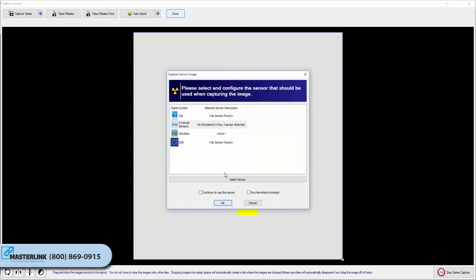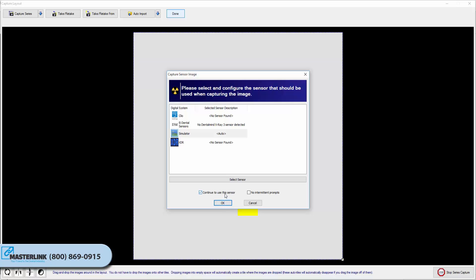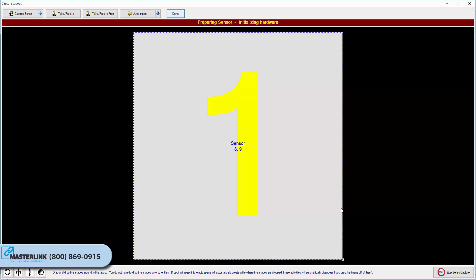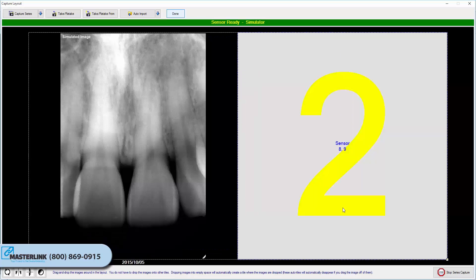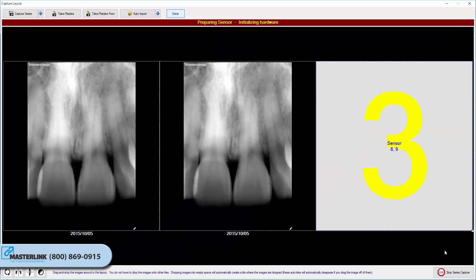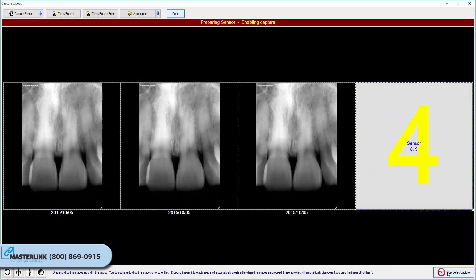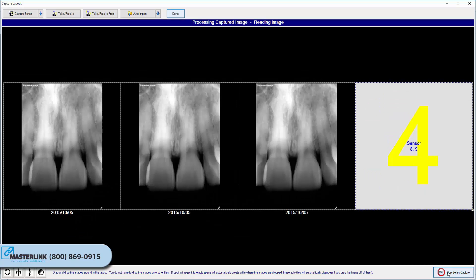The Capture Layout screen will then appear. Click the Capture Series button in the top left of the window, and choose the sensor that you wish to use from the list. Click OK. The sensor will ready, and you will be able to take the first image in the series. Once the image is returned, another tile will be created, and the sensor will automatically ready itself for the next exposure.